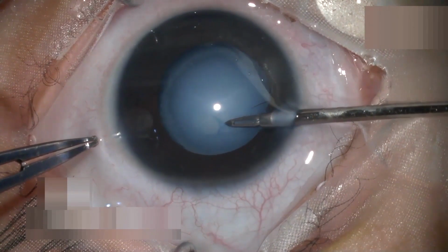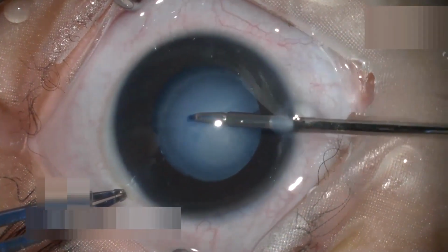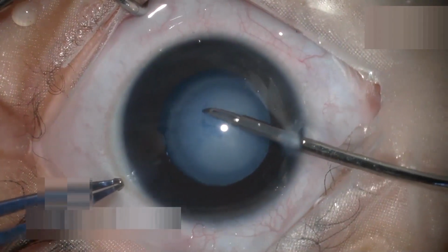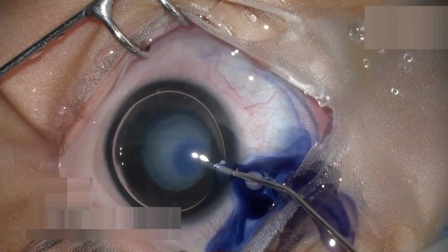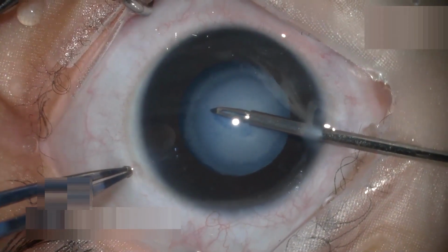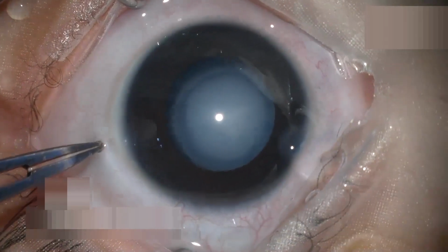In circumstances of poor red reflex on coaxial illumination as seen in total cataracts, the contrast can be enhanced by staining the anterior capsule with trypan blue dye. Trypan blue is injected under the air bubble in the anterior chamber for uniform staining of the anterior lens capsule and provides a color contrast during the capsulotomy known as blue rhexis.